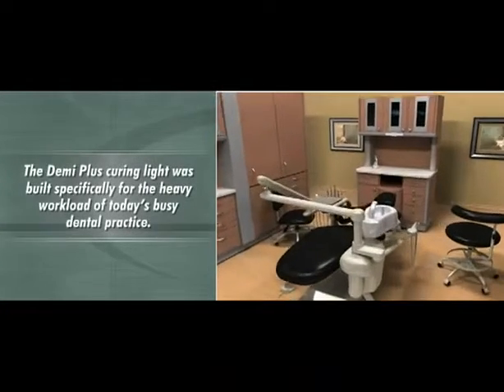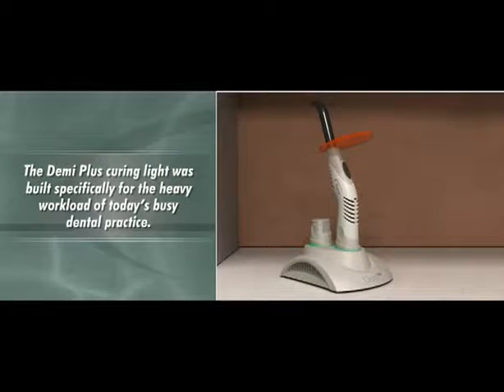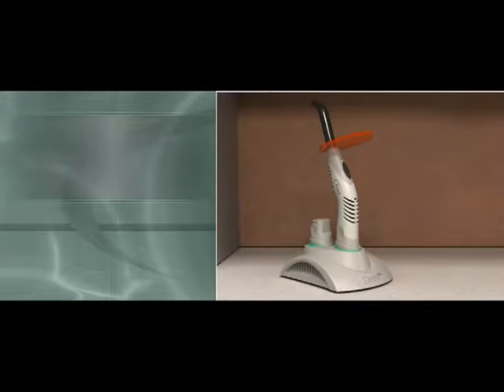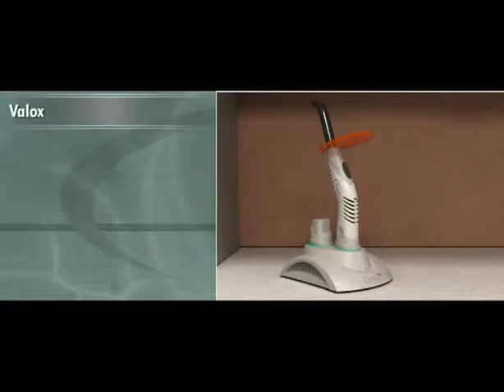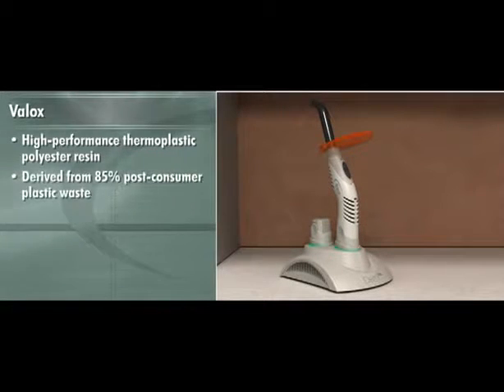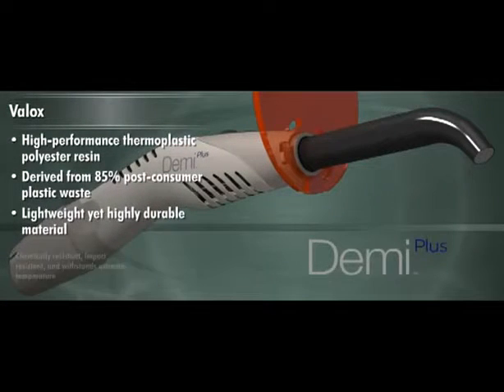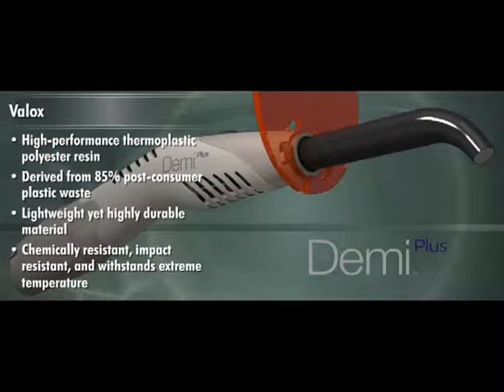The Demi Plus curing light was built specifically for the heavy workload of today's busy dental practice. The handpiece is comprised of Valox, a high-performance thermoplastic polyester resin that has been tested in the consumer world. Derived from 85% post-consumer plastic waste, the lightweight yet highly durable material is chemically resistant, impact resistant, and withstands extreme temperature.